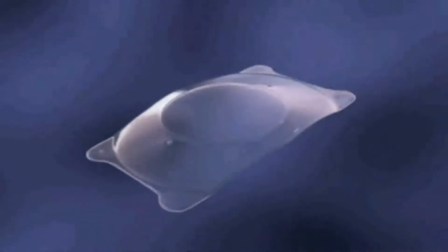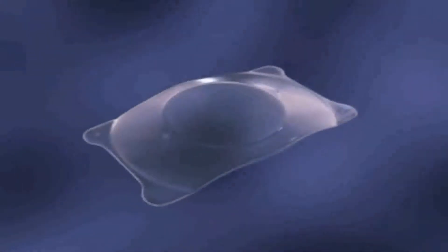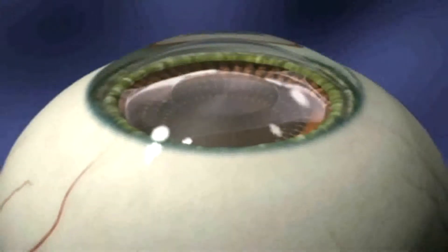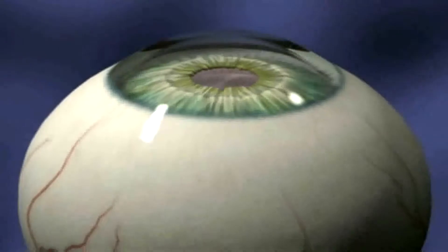This chapter will provide an animated guide to implanting the Star Vizion Surgical Implantable Contact Lens, or ICL. Remember, in cataract surgery the crystalline lens is removed. In ICL surgery, the crystalline lens is preserved.